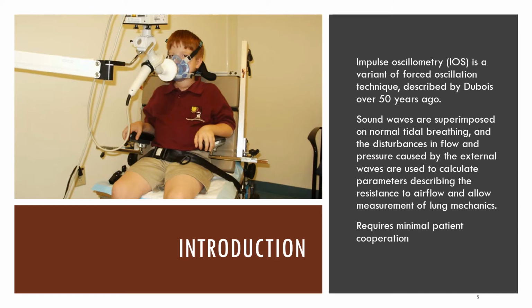Okay, thank you. Impulse oscillometry, commonly known as IOS, is a variant form of forced oscillation technique, commonly known as FOT, and it was first described over 50 years ago by Du Bois. The benefit of this test is that it allows measurement of resistance and compliance with passive breathing. So the patient breathes a normal tidal volume in and out, and then they superimpose some sound waves on top of that.